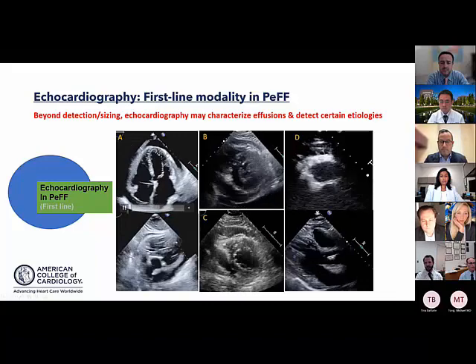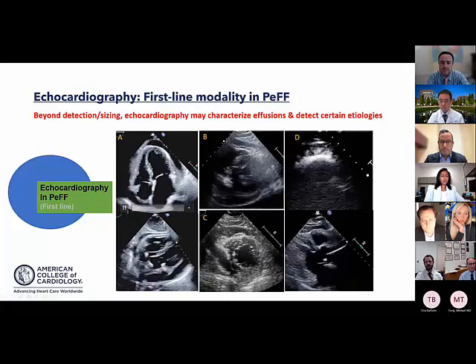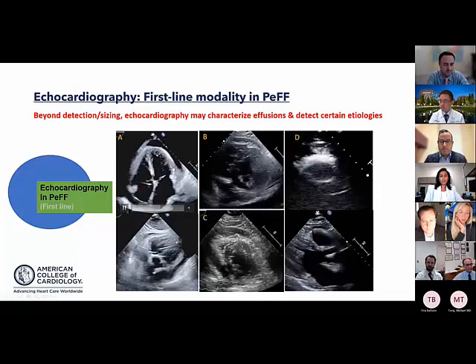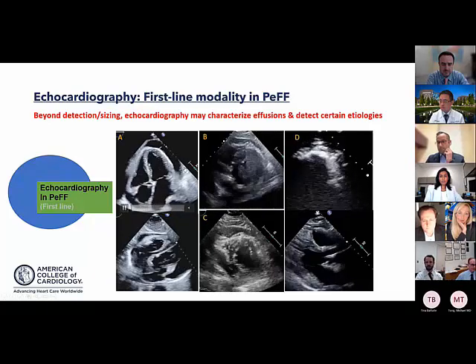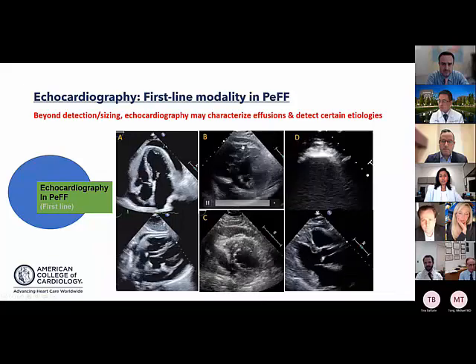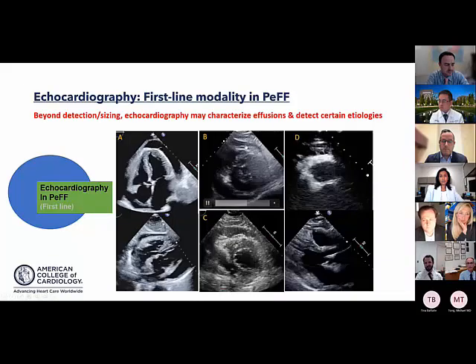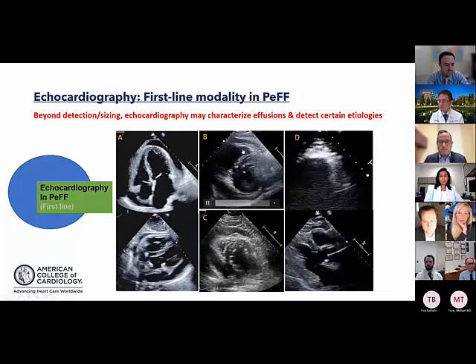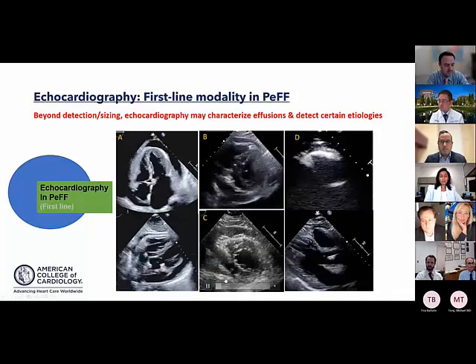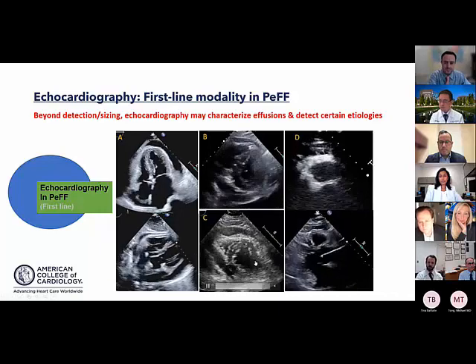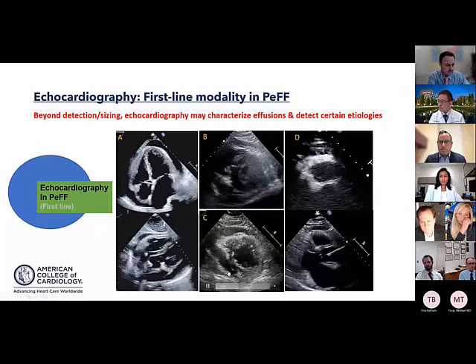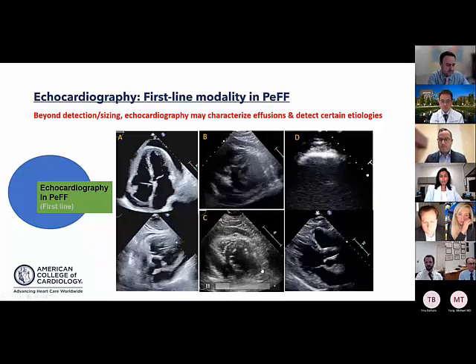Comparing to Case B, where the effusion is echogenic and the pericardial layers appear to be stuck together, raises suspicion for a complex exudative, likely inflammatory effusion. Case C — the first case presented at the beginning — shows echo-dense material within the pericardium in continuity with the infarct zone, along with a less dense surrounding effusion, raising concern for a contained rupture.